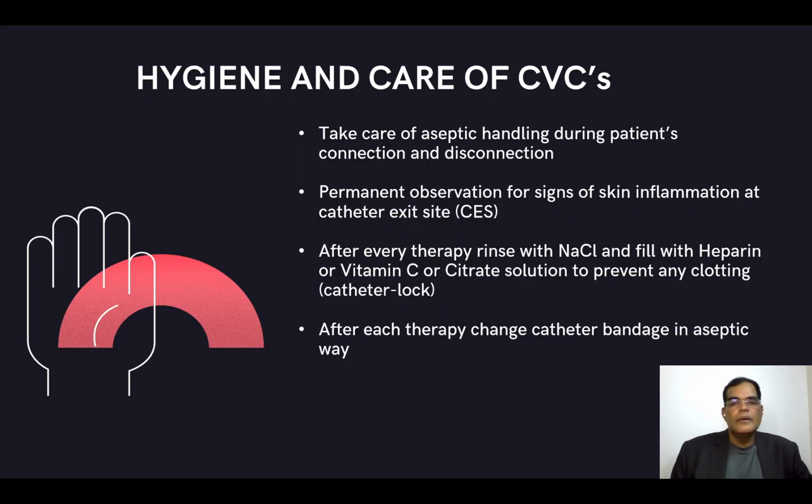Again, we need to take care of the catheters in an extremely good way, otherwise we will end up in various trouble. So aseptic technique in handling the catheter is very, very important, especially during connection and disconnection, because these are the two times when the catheter is exposed outside and getting open.